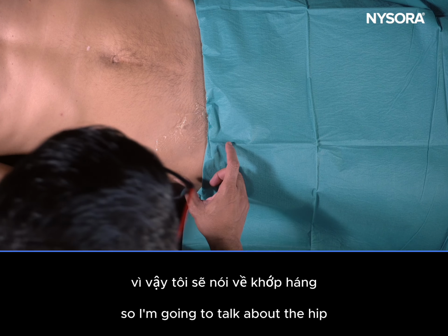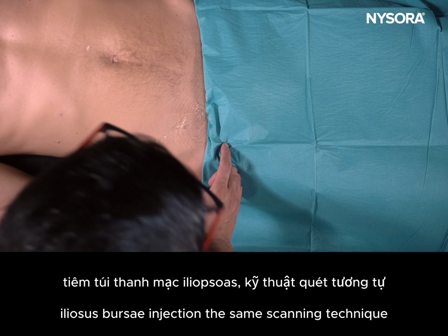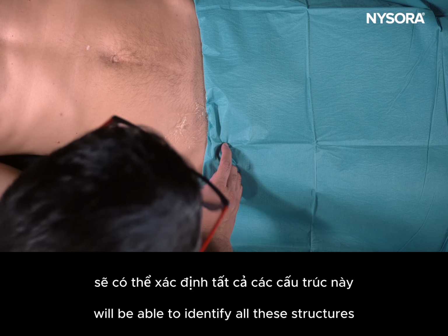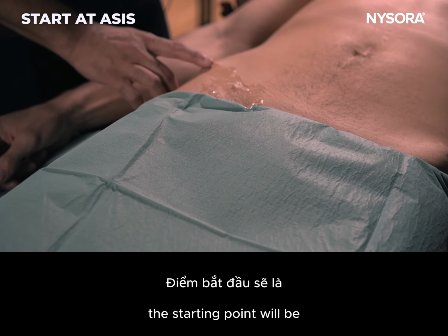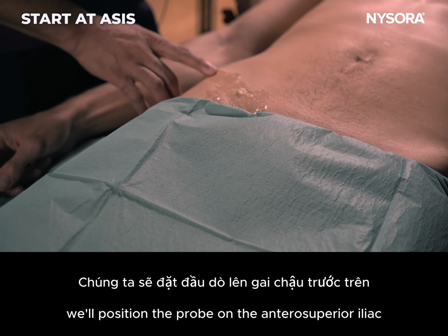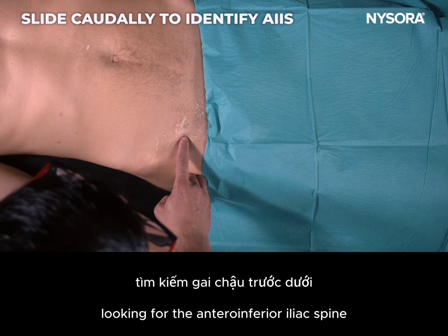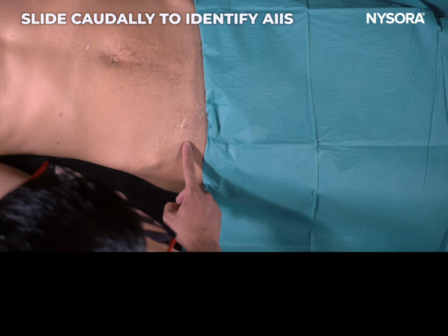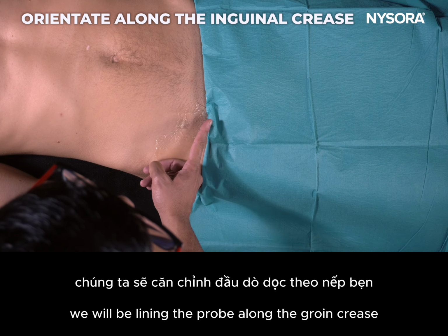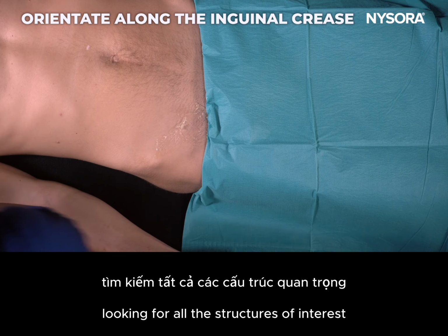So I'm going to talk about the hip articular branch blocks, PENG block, and iliopsoas bursa injection. The same scanning technique will be able to identify all these structures. The starting point will be palpation of the anterior superior iliac spine. We'll position the probe on the anterior superior iliac spine. We will move the probe caudad looking for the anterior inferior iliac spine. Once we see it, we will line the probe along the groin crease looking for all the structures of interest.